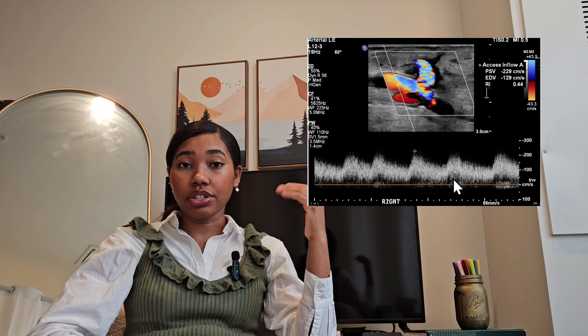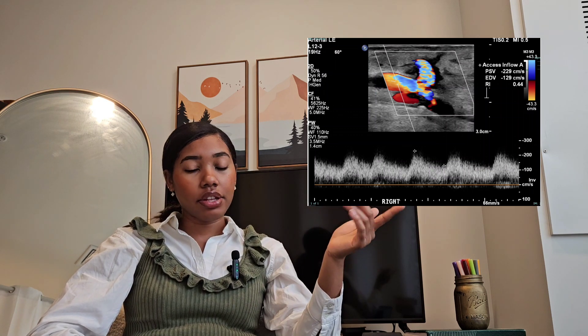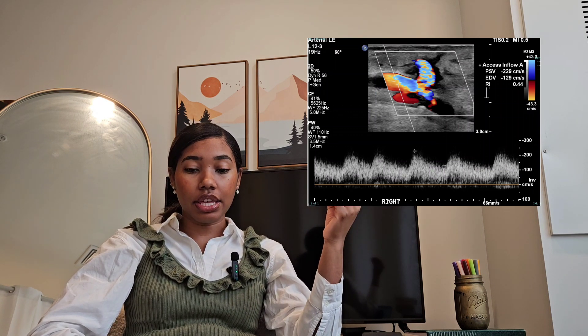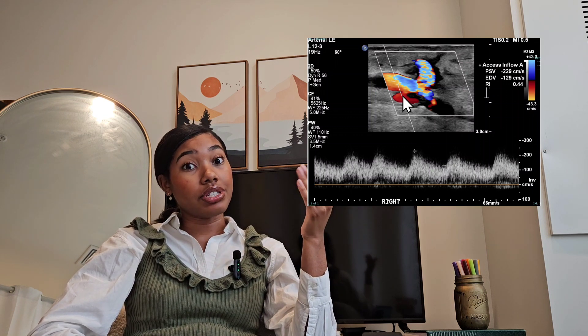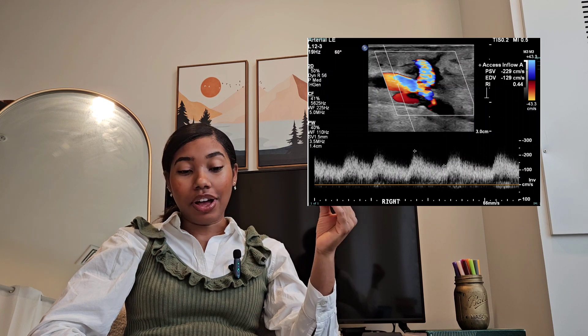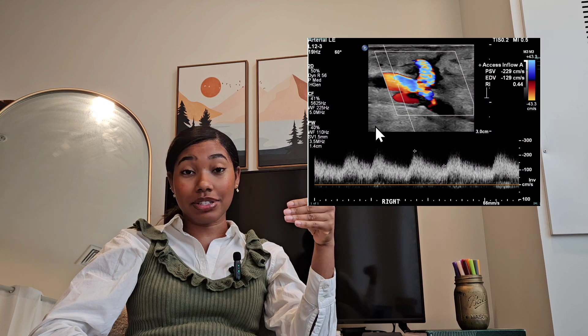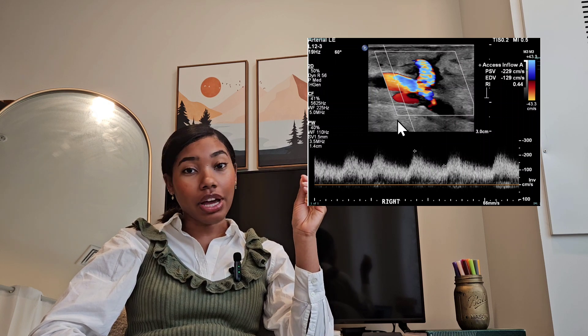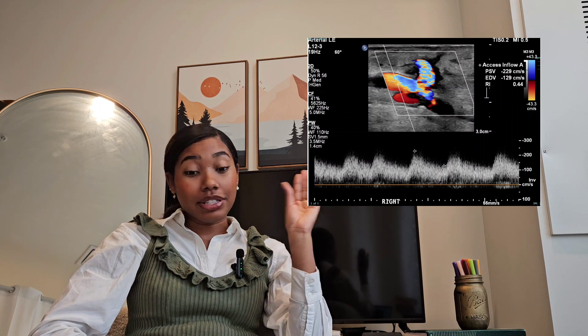Then take a spectral Doppler of the inflow — make sure your angle is parallel to the vessel walls. Then check the proximal anastomosis. That can be where you see an issue, as I did in this scenario. I've been trying to find a normal dialysis fistula for this video, but every single one I come across at my job is abnormal, so this is what we've got.